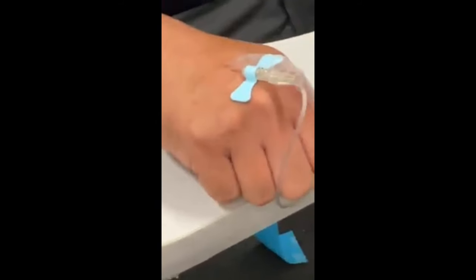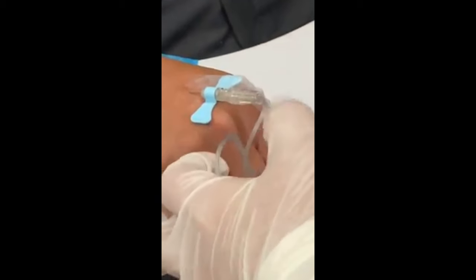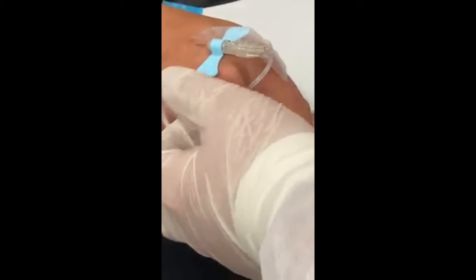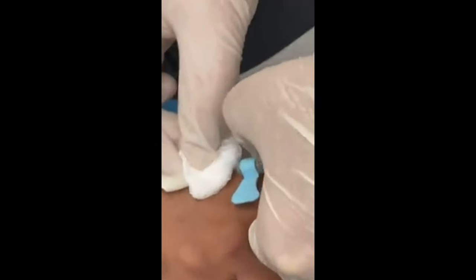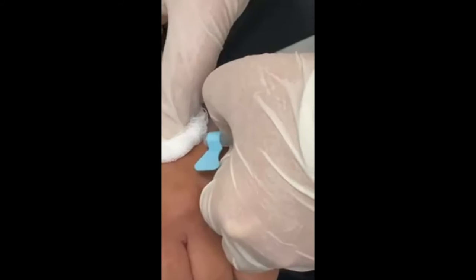Perfect. So at this point now you can remove the needle, but before you remove the needle, what do you have to put at the top? Or we'll practice pressing the button. Before you press the button, go ahead and get your gauze and put it on top of the needle. Then hold the gauze in place, and at the same time press the button, that button right there with your fingertips. There you go. Can you apply some pressure? Perfect. I'm applying pressure.